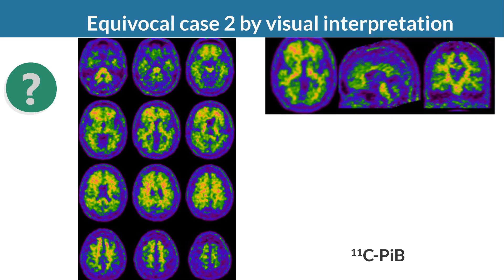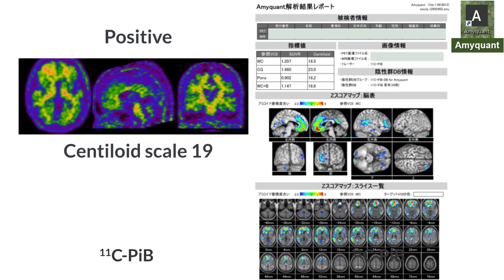In another equivocal case using carbon-11 PIB PET, the right frontal cortex seems to show somewhat increased accumulation. The centiloid scale is 19. The frontal cortex and posterior cingulate gyrus show significantly increased accumulation on the Z-score map, also suggesting amyloid positivity. To become proficient in evaluating amyloid PET, combined use of visual reading and quantitative assessments using centiloid scale and Z-score mapping is useful.